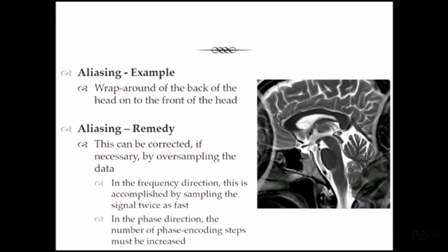So while we're here just looking at this image, this is a T2 weighted sagittal image of the brain. Remember I was saying to you before that just thinking about that decay of signal, if we look at our FID, we're just looking at proton density. The longer we wait, the more we can differentiate tissues. So here's a really nice example where in the brain, sagittal T2 weighted, all the bright areas are CSF, darker areas are brain parenchyma. We can see the difference between surface grey matter and deep white matter. So here's our grey matter and here's our white matter.